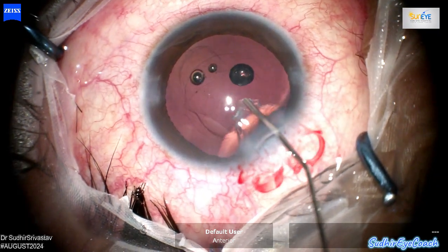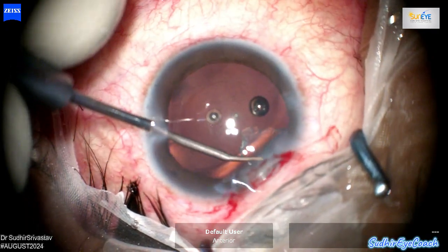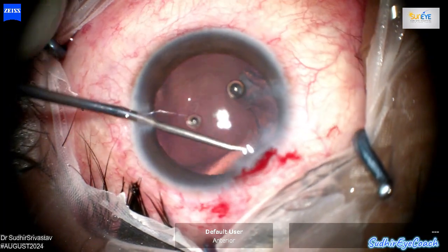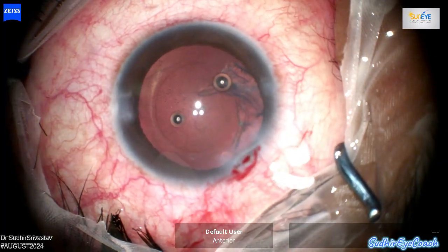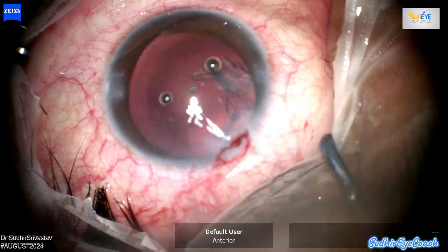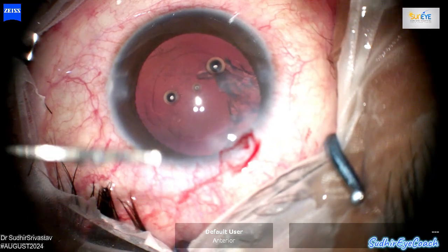Again I filled the anterior chamber with viscoelastics to prevent vitreous from coming out through the posterior capsular tear. The cortical matter was located in the sub-incisional area, making it challenging to remove with the coaxial I/A. I attempted to physically manipulate the cortical matter to reposition it into a more accessible area for safer and easier aspiration. I considered using a bimanual cannula for better access but decided against it to avoid excessive fluid movement in the anterior chamber, which could potentially extend the tear.